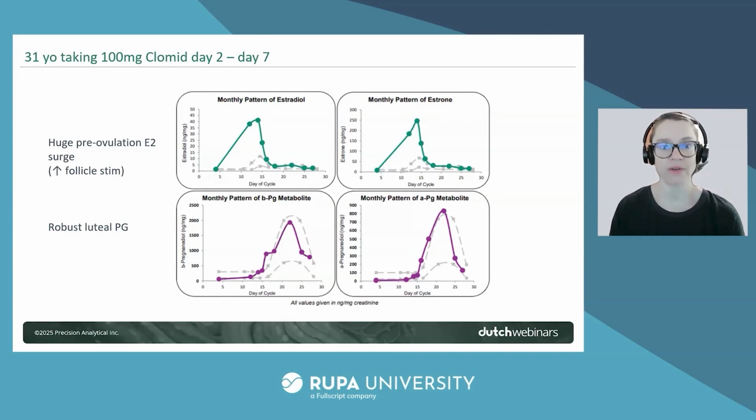She's recruiting a lot of follicles. It's working. It's doing what it's supposed to. The estrogens then do settle down to pretty normal luteal ranges after ovulation occurs, and then her progesterone soars. So again, we get really nice, big, robust progesterone, high normal, which is what we typically expect on these fertility meds. Doesn't look like she got pregnant this cycle. We do sometimes see that they do, and what you would expect to see is that estrogen and progesterone past that mid-luteal peak would continue to rise. They wouldn't have that drop that triggers a menses.